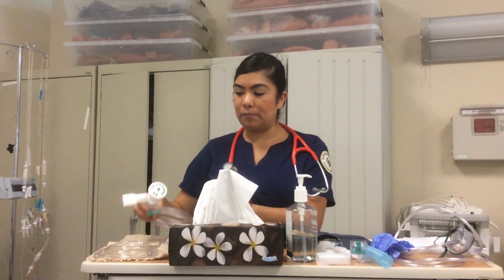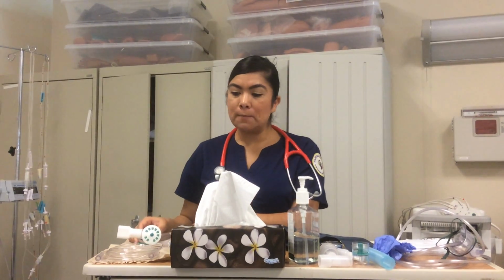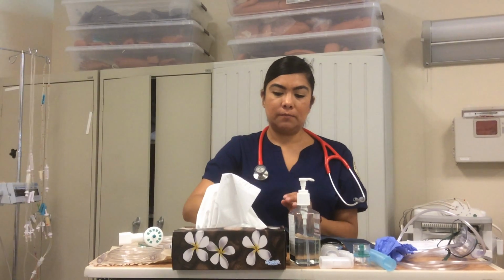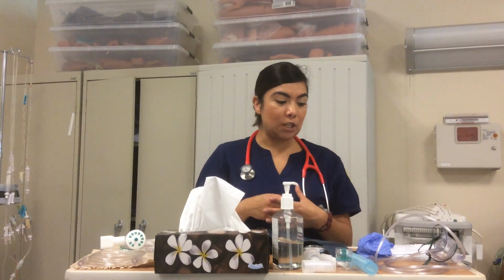So we have our peak flow, and then we have our breath actuated or continuous mouthpiece here. I'll demonstrate this in a bit, okay? And then we're going to use our O2 saturation, some Kleenex because we're going to need the patient to cough, blood pressure cuff, gloves, of course, our hand sanitizer to clean our hands, and then the rest of the material for the mouthpiece in regards to how they're going to get their medication.